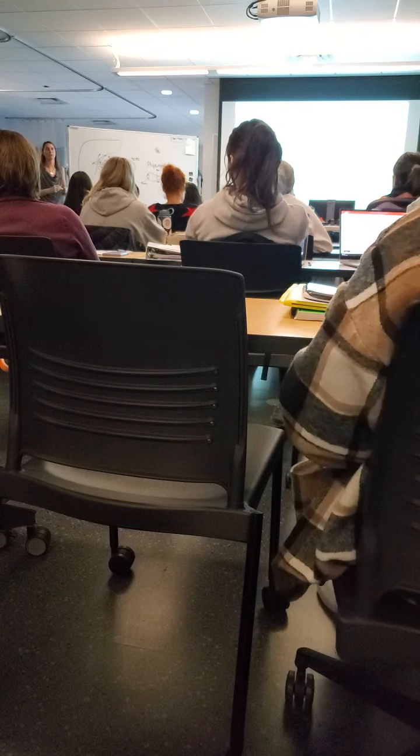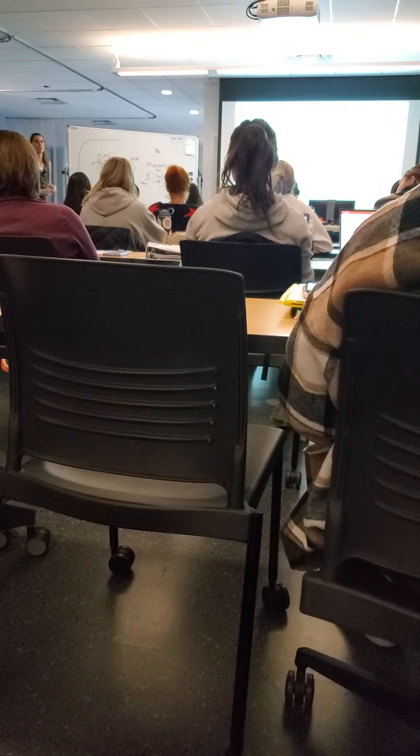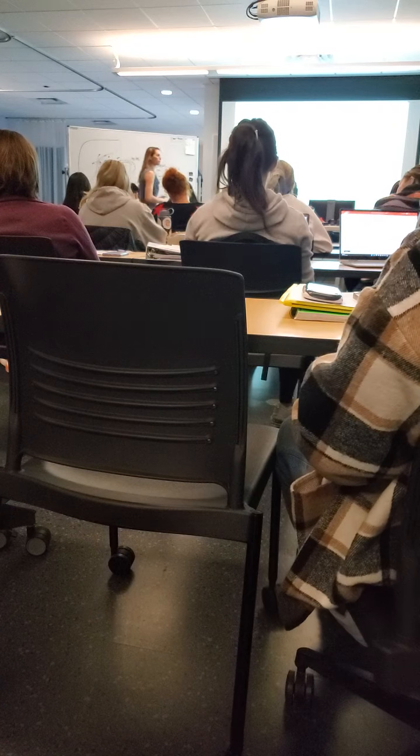And then we're going to evaluate this common bile duct, this extrahepatic biliary duct. Now, I'm such a cool sonographer, I'll also measure my common hepatic duct as it leaves the hepatic. But pretty much, we're going to try to elongate this out as much as we can, and do a measurement of this. That's that millimeter per decade, and your book says less than 6. So we'll get to that in a while as well.